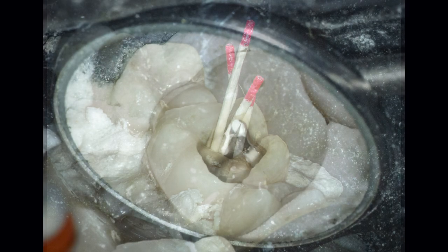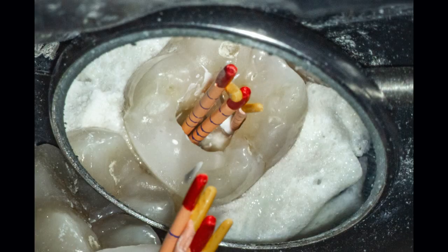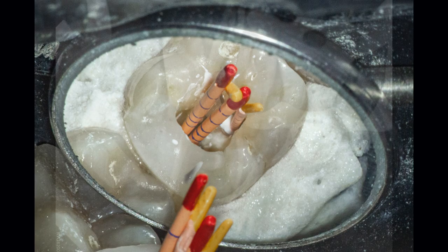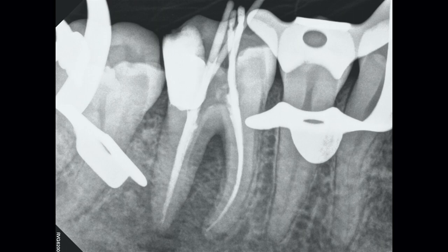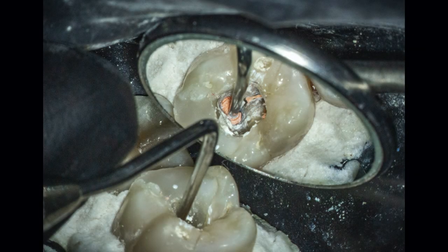The canals are dried and I obturated using a single cone obturation technique. This is the cone fit radiograph, which confirms the proper placement of my obturation material. I was happy with it, so I went ahead and completed the case. The cones are seared off at the level of the orifice and the treatment is completed.